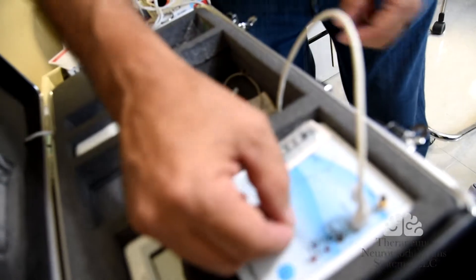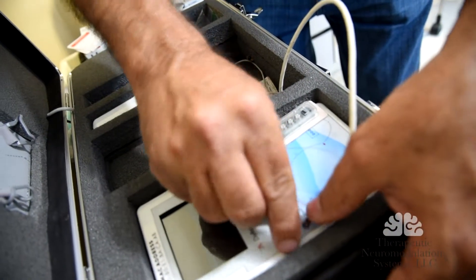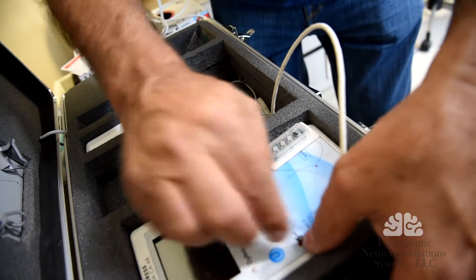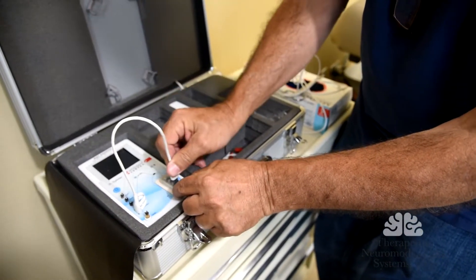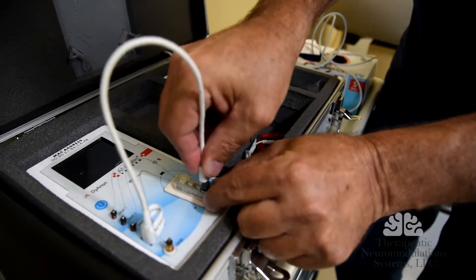One, two, and three. To me, it felt like if you were to put it on — if you were 40 and you turned it on — you felt like you were 30, almost 10 years younger.